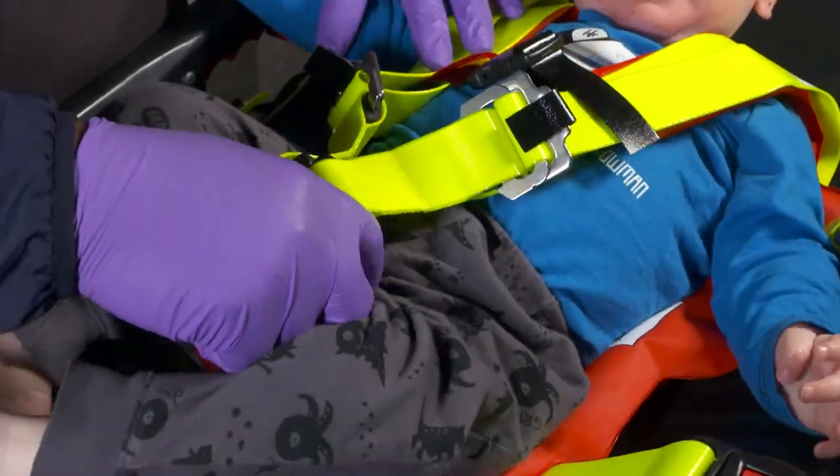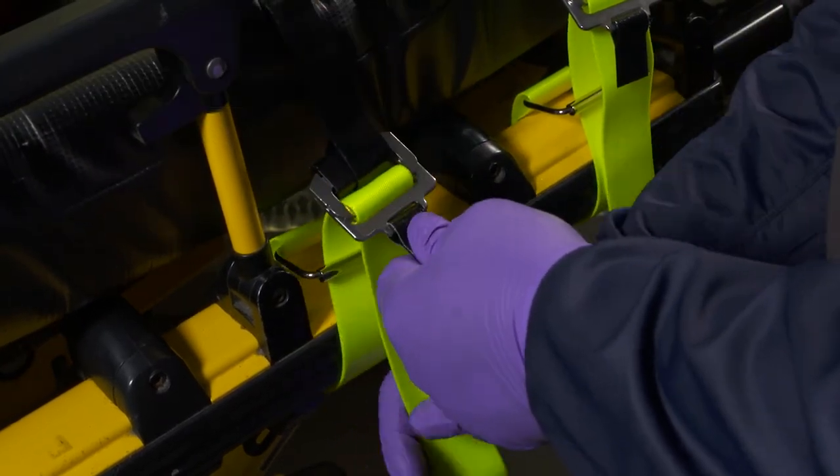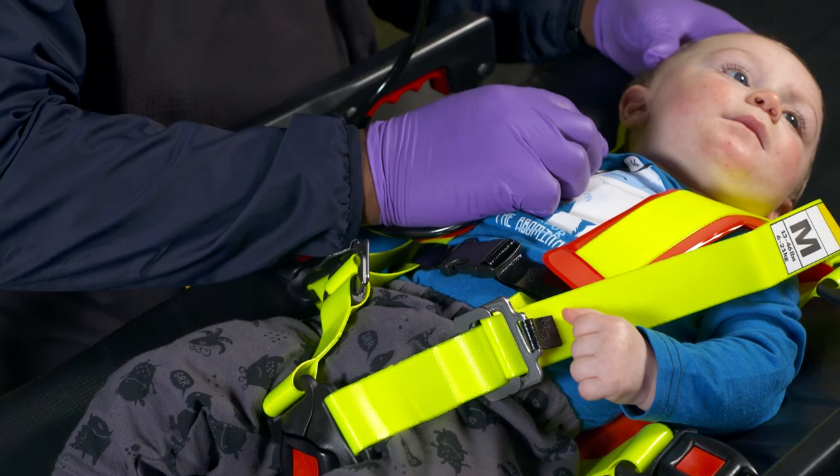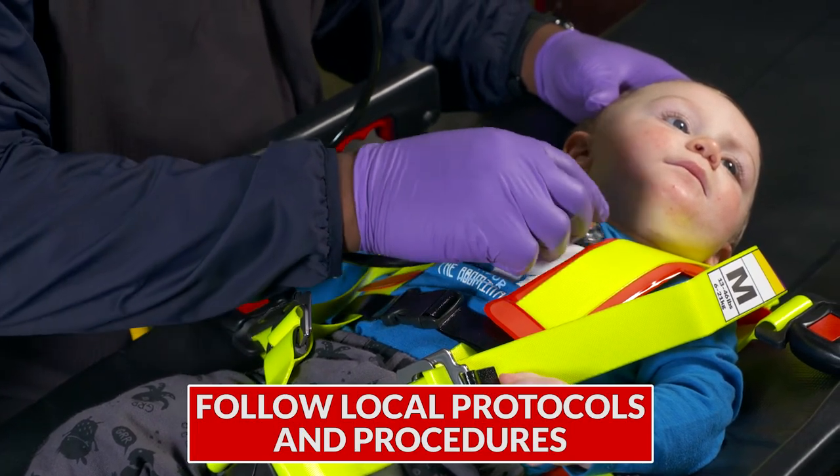Now that your patient is secured in the harness, pull the tabs on each cot strap to further secure the harness on the cot mattress. Your patient is now secure and ready for transport. Always follow your local protocols and procedures.